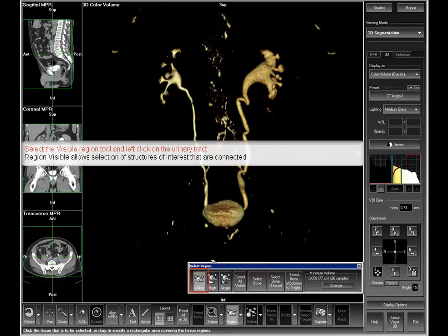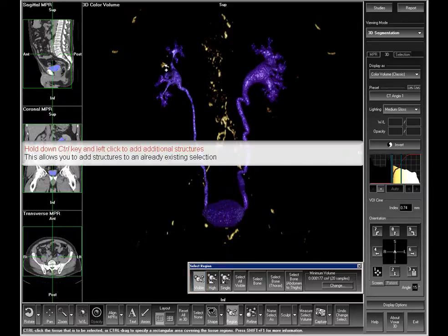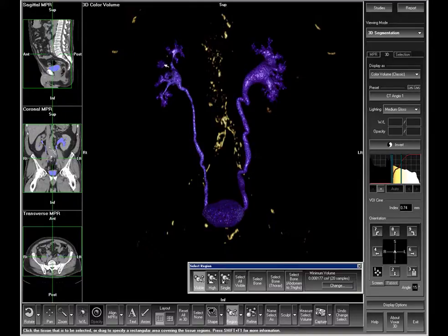Click region visible and left click on the bladder or one of the ureters to select them. Any additional area can be added by holding down the CTRL key and left clicking on the structures to be added to the selection.